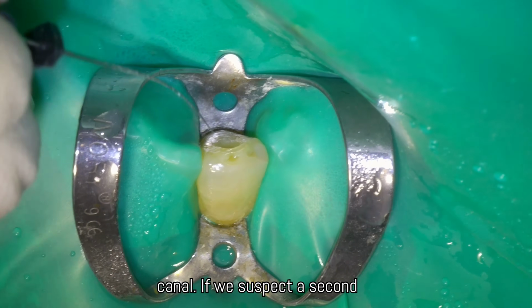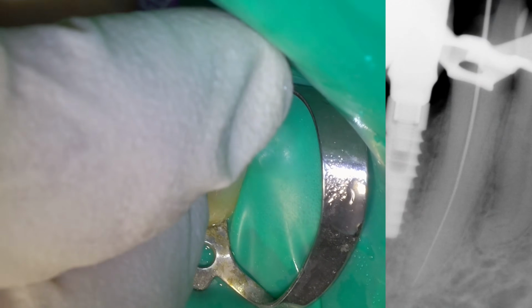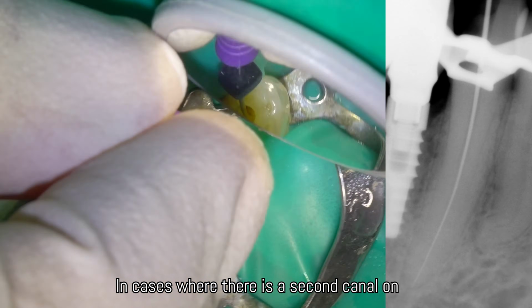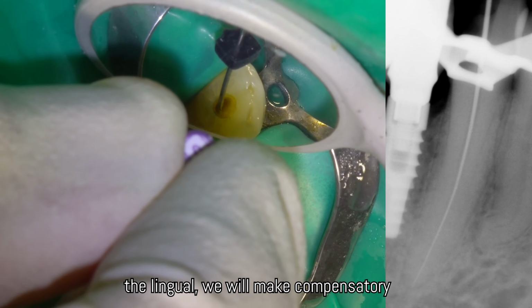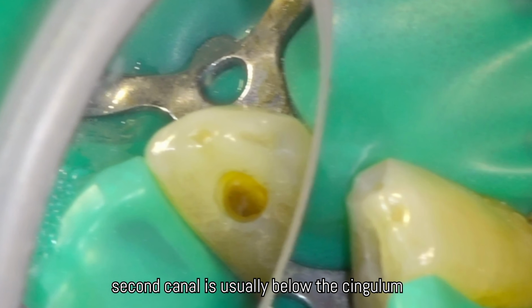If we suspect a second canal, we would have to open something more lingually with an endo-Z burr. In cases where there is a second canal on the lingual, we will make compensatory wear of the cingulate dentin. The second canal is usually below the cingulum.